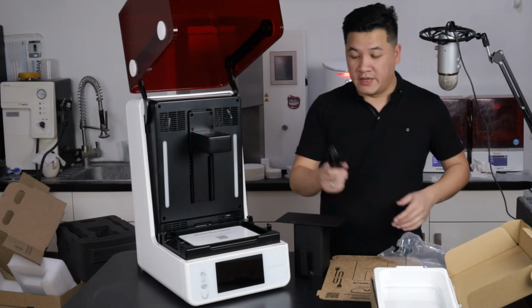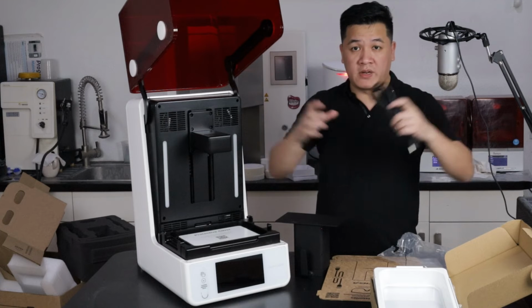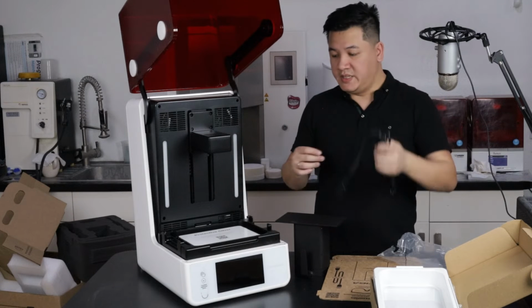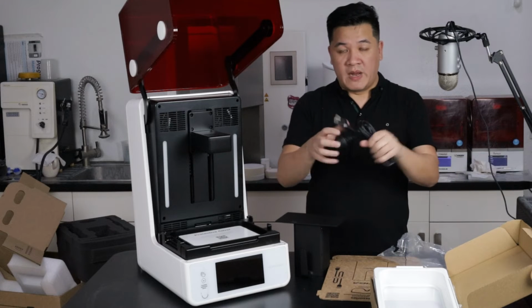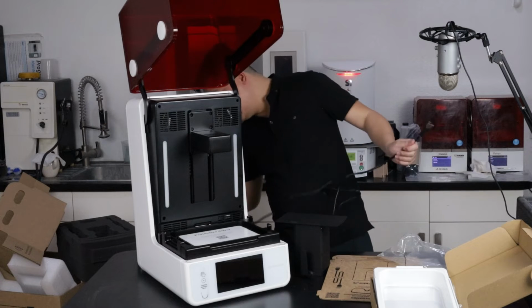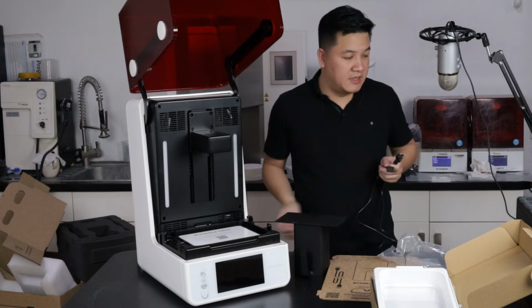Oh, the other cool thing, I guess, is kind of subtle, but on the Maxes you have your power brick on the outside, right? So it has this 3-prong PC cable, and then you plug it into your power brick, and then that plugs into a DC adapter. This one plugs directly into the back of the printer. So all the power components are actually inside.